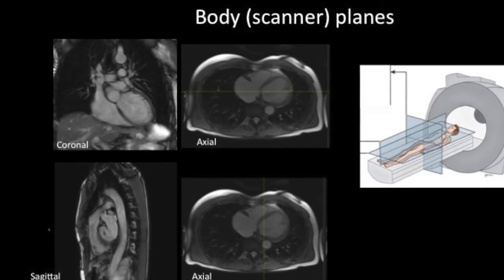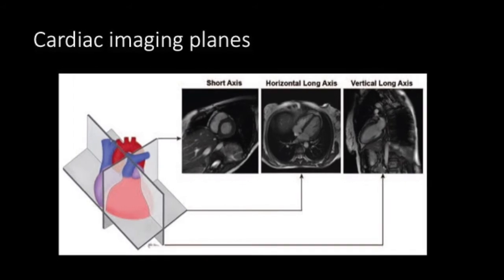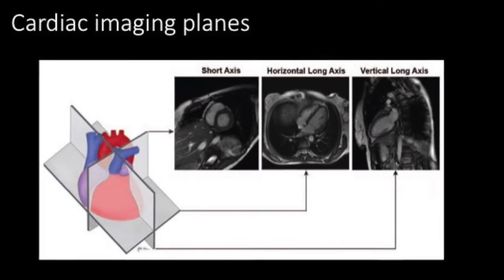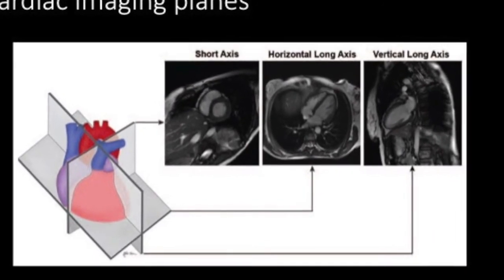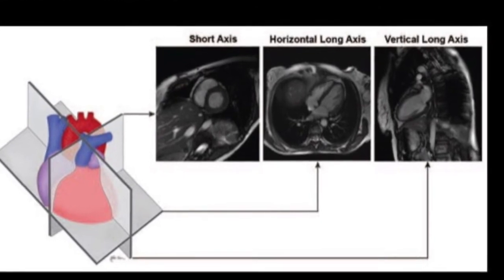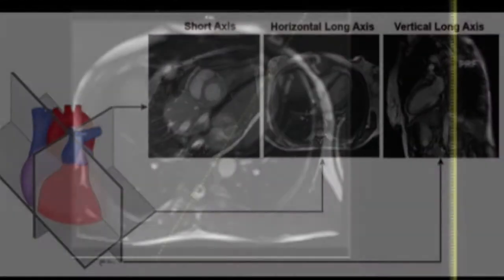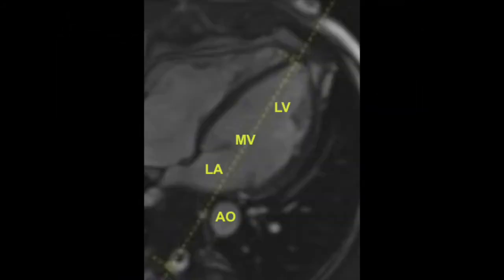The standard cardiac planes are established using the scout images and include the short axis, the horizontal long axis or four-chamber view, and the vertical long axis or two-chamber view. First, we derive the two-chamber or vertical long axis view. This plane is prescribed along a line extending from the cardiac apex to the center of the mitral valve, using the axial body plane images.